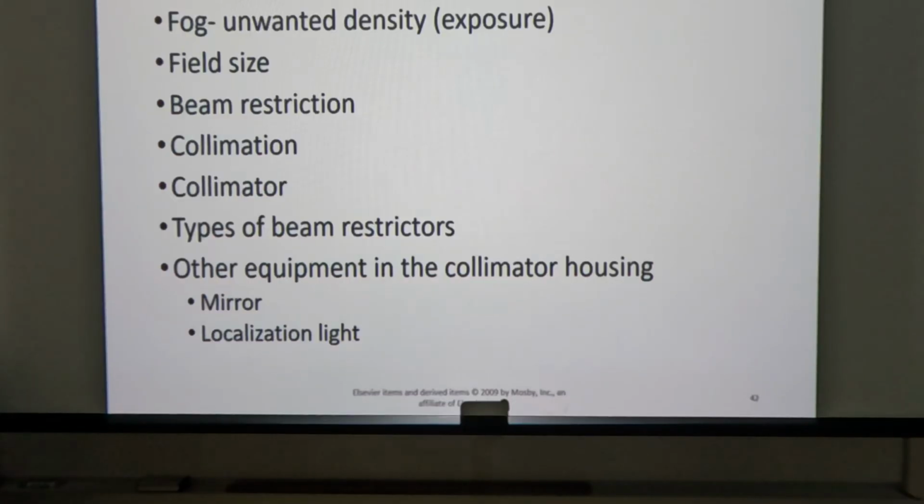It's a density present on the image receptor. So if you clean up the scatter, regardless of if it's pre-patient through collimation or post-patient through grids, then you're removing some of that density, okay? You get rid of it as unwanted exposure. Let's change that to exposure to the image receptor.